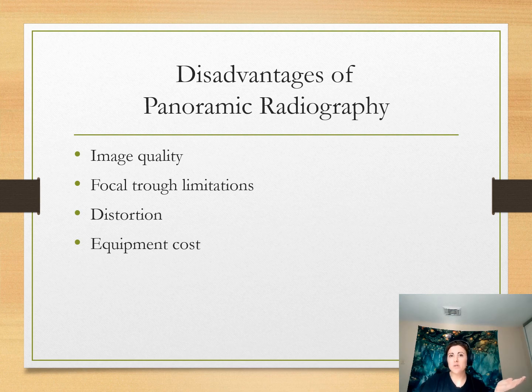And then the last one is equipment costs. This means that it's very expensive for a dentist who is straight out of school or is opening their own practice to buy this very expensive machine. It's more expensive than probably anything else that they have in the office. And so, I talk about the one who has the panoramic that sings Beethoven to her. She's going to be paying on that piano for many years.